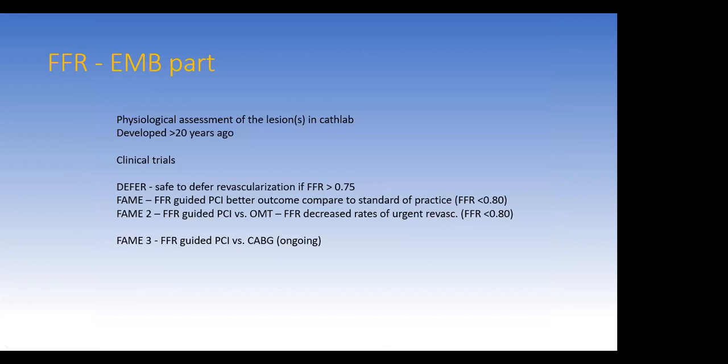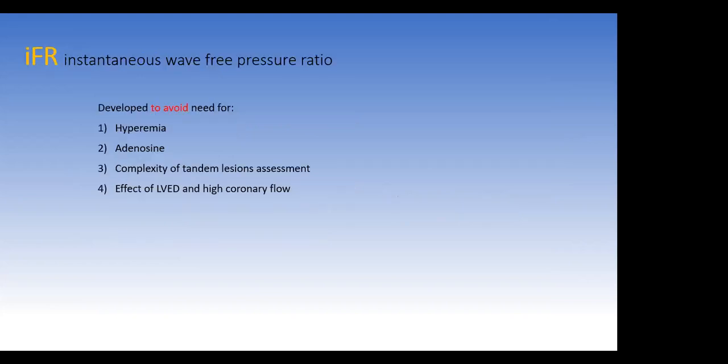There are multiple trials that were done, DEFER, FAME2 and FAME3, essentially delineating the points, i.e. 0.75 for ischemia and 0.8 for clinical significance.